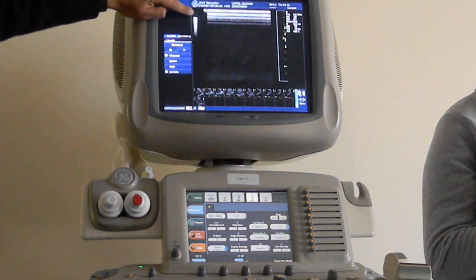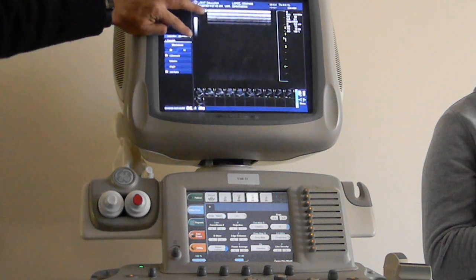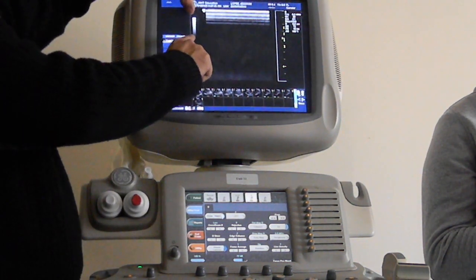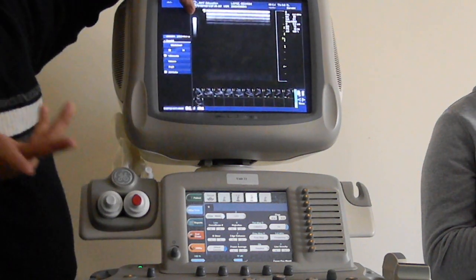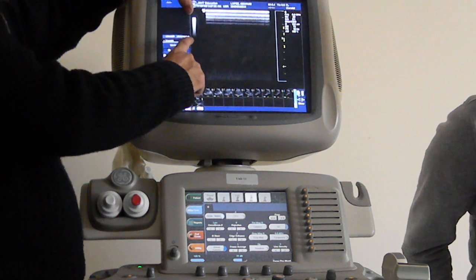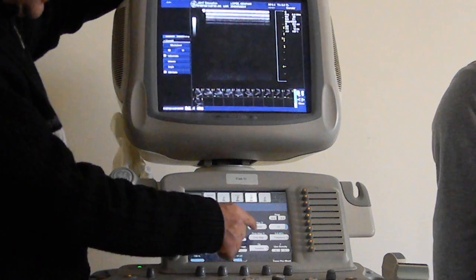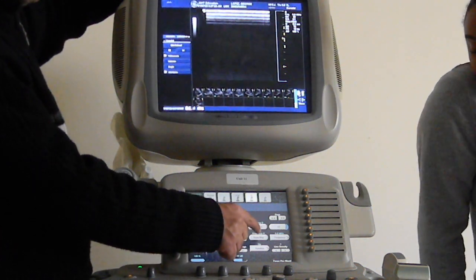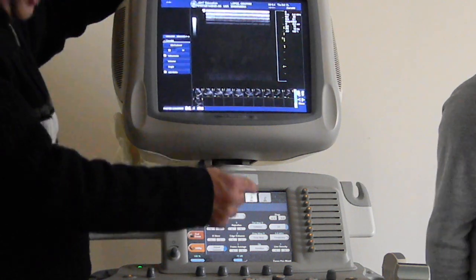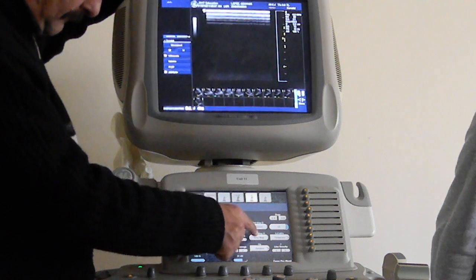This is the map we have on right now. You may say, well, I don't like this gray map. You don't like it, you're not going to like the other ones either. But you may choose another gray map. There's a slot right here on your screen, and as I told you, this screen is a touch screen. So you may just touch on gray map.